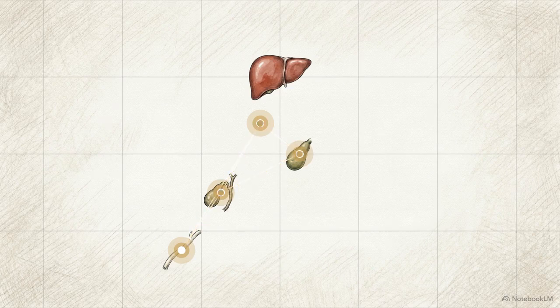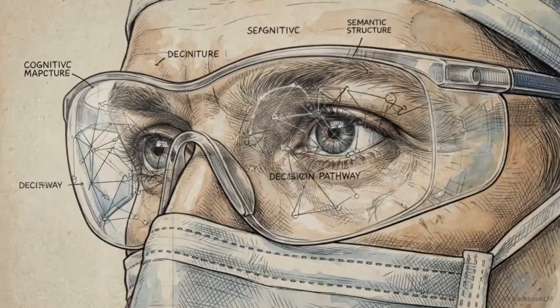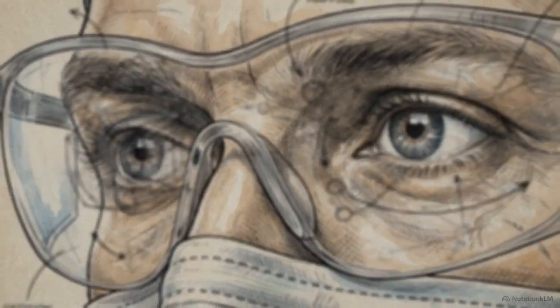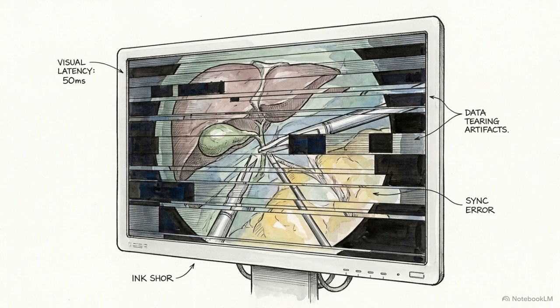The network processes this encoded geometry to classify whether the physical relationships between the duct, the artery, and the gallbladder definitively meet the criteria before the surgeon makes a cut. By processing semantic geometry rather than raw pixels, graph neural networks effectively mimic and verify the internal cognitive checklist of a master surgeon. All of this predictive power is useless if the system causes visual lag on the surgeon's monitor.